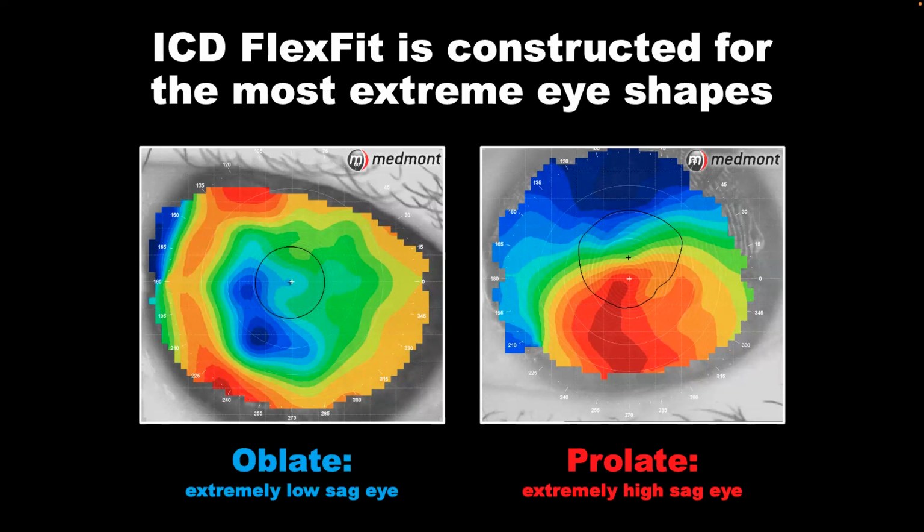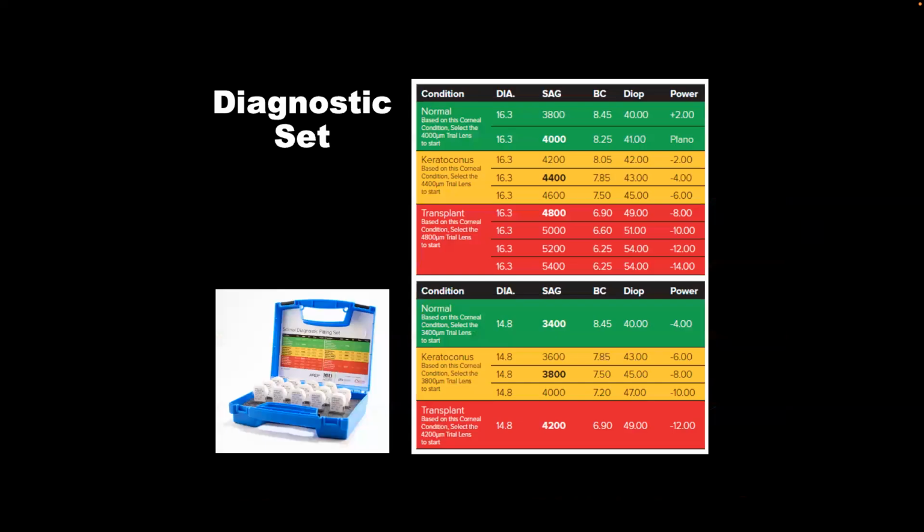The lens has four, let's see, four zones, sorry. I was just trying to remember. So we will talk a little bit about those zones later on.